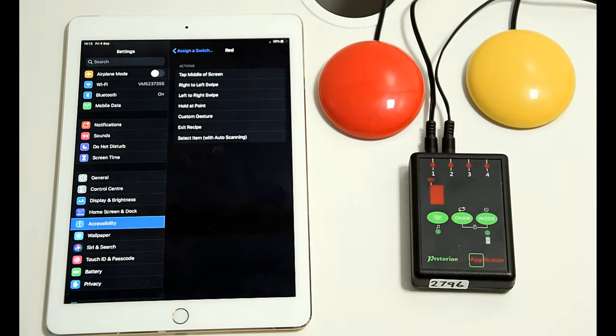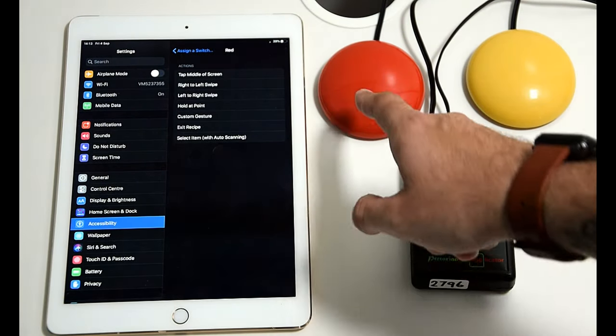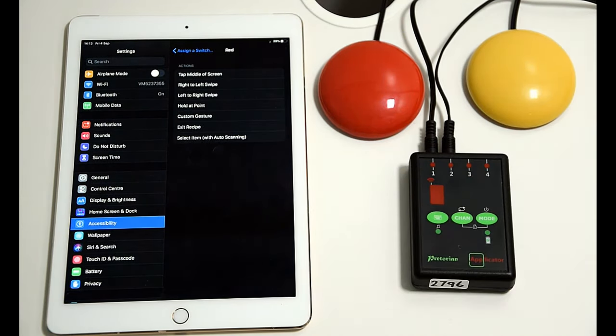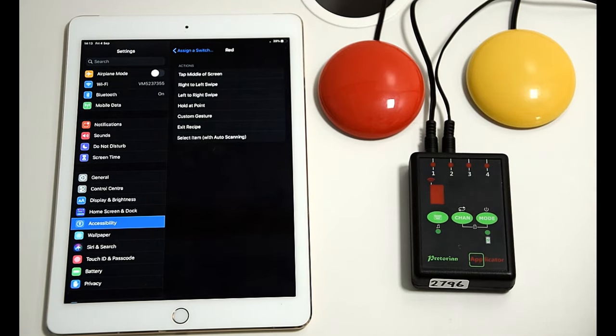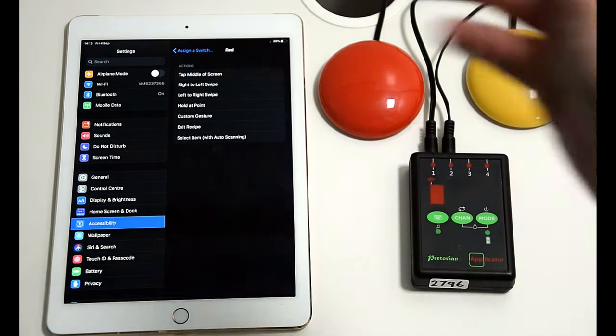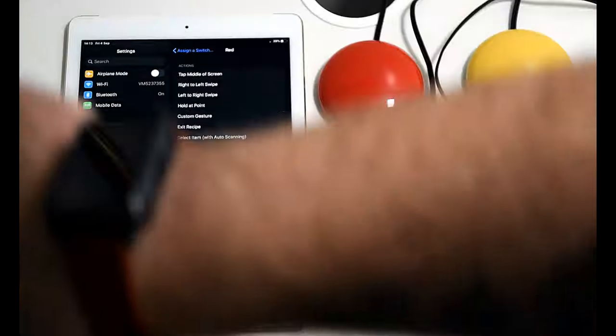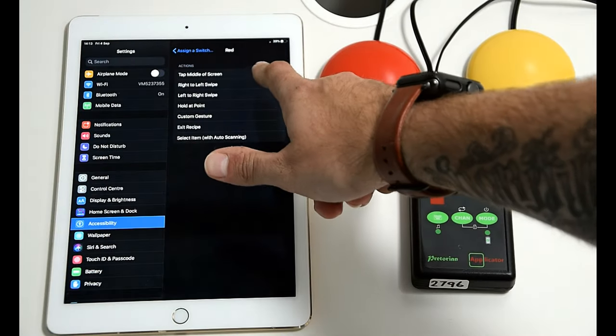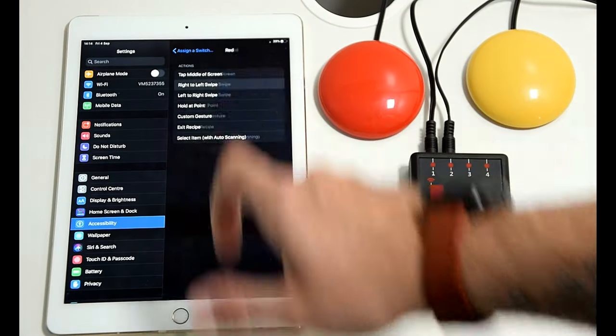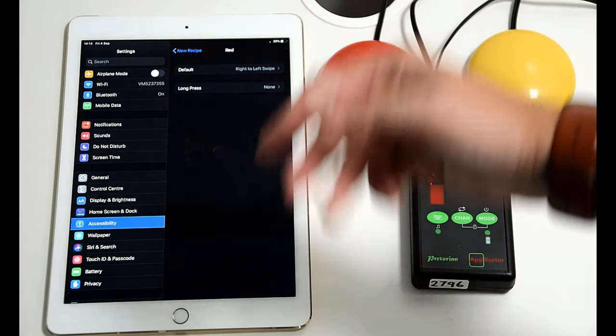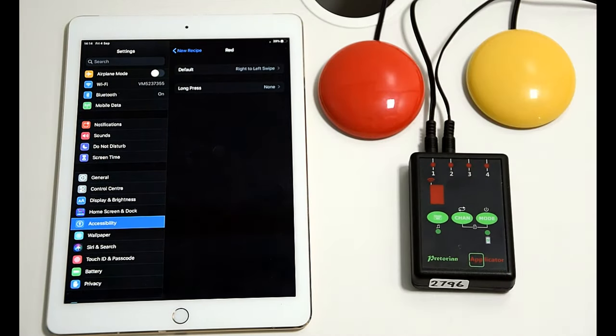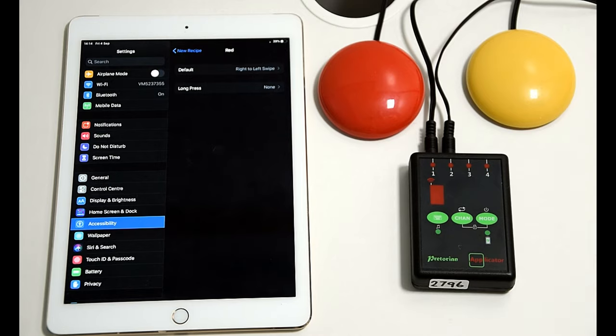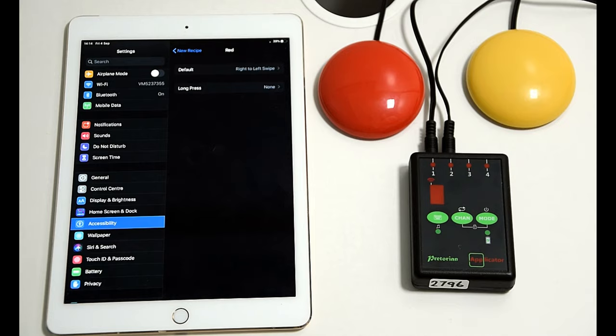Now we'll go to red first. Now the red switch, we want to be flicking the page over forward, so that's right to left, so we'll be turning the page that way. So we'll go right to left swipe and you'll notice there's other options in there. So the recipes, the preset recipes are there for lots of different things that you can't normally do as a standard.